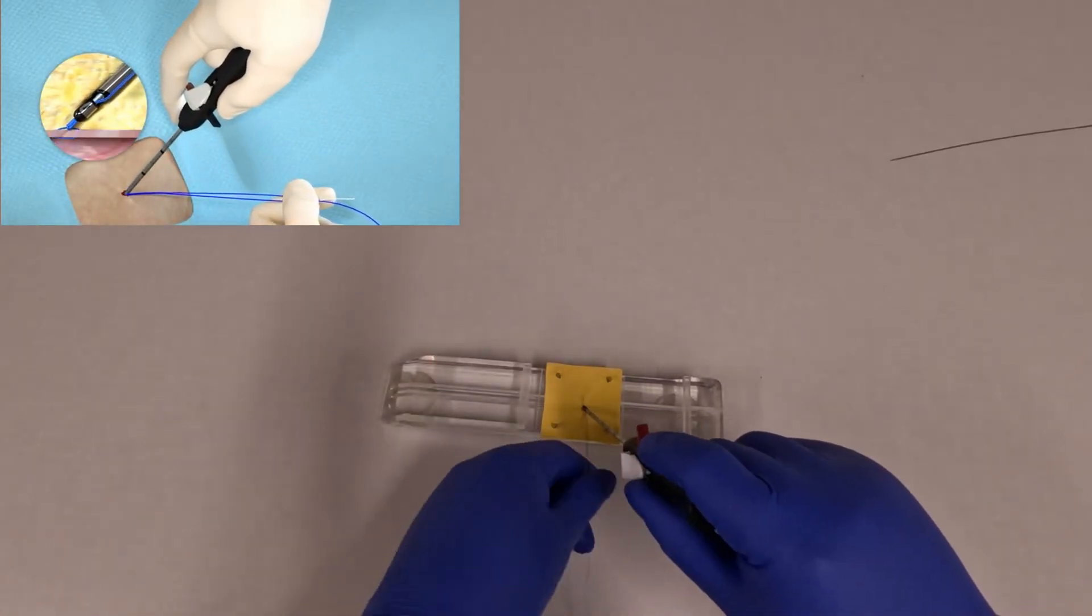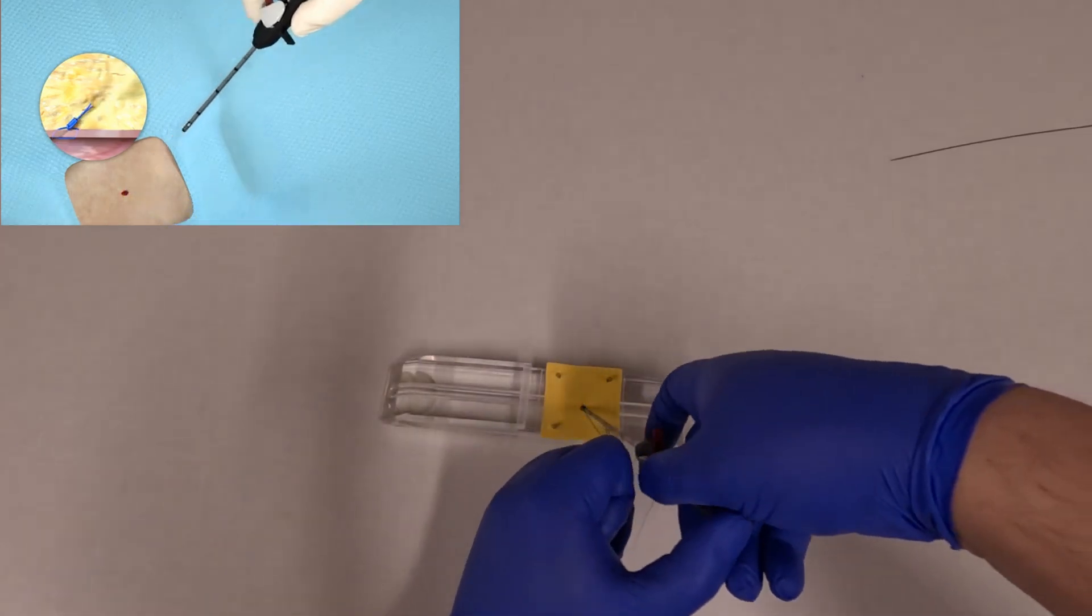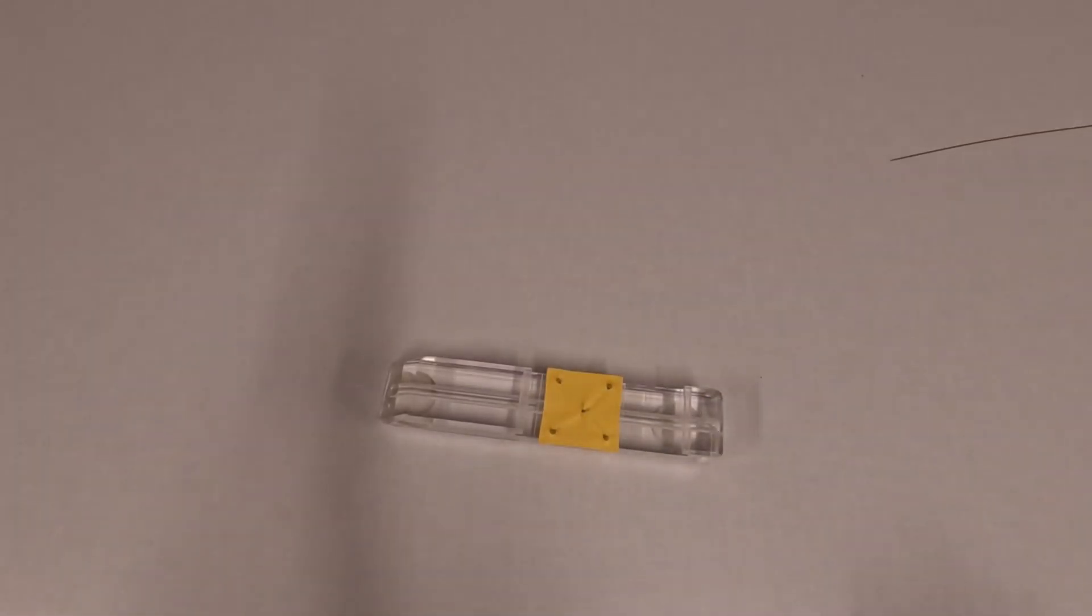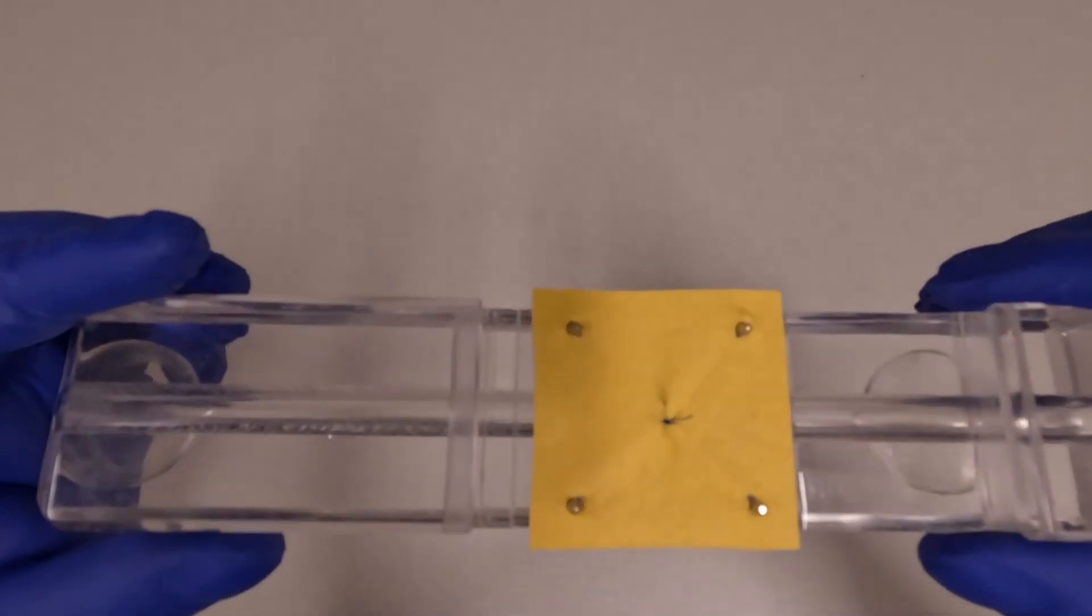And then walk the suture cutter down, and you'll feel resistance when you approach the arteriotomy. Again you pull on the suture, and then pull the red lever to cut. This deploys the Perclose suture, and we're complete.